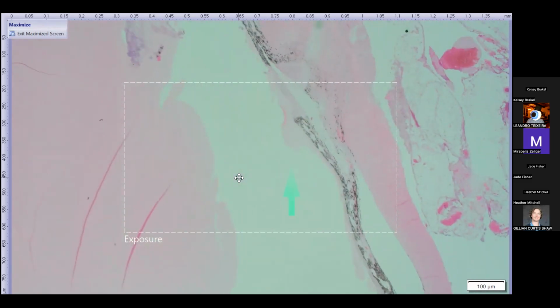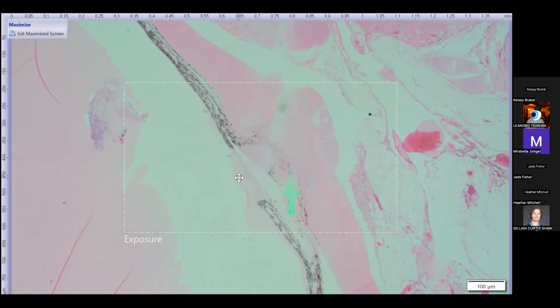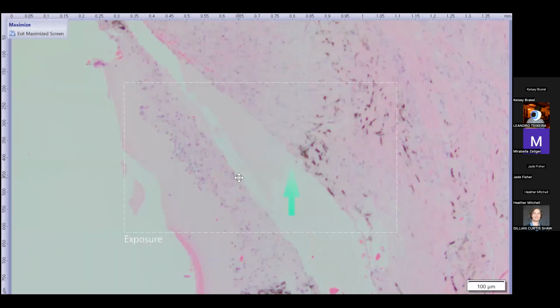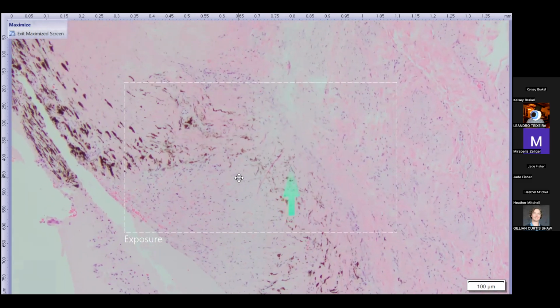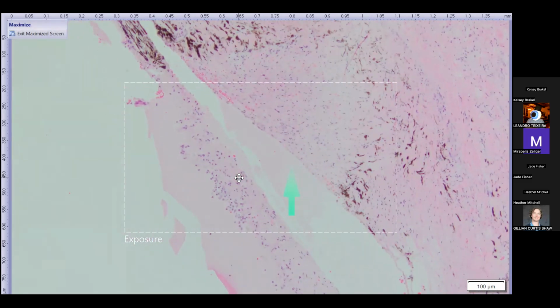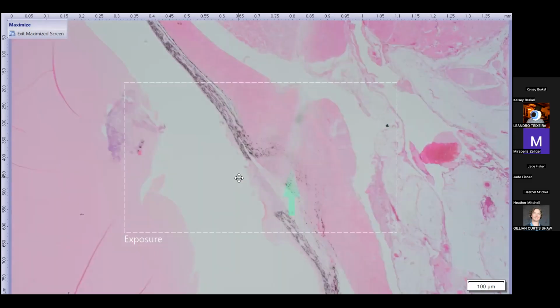And we don't have optic nerve, but in the posterior sclera here in the choroid, there is a defect and discontinuation that's replaced by some fibrosis. And if we follow it out, it's probably a little tract here from where the stick entered the eye from the back of the globe.